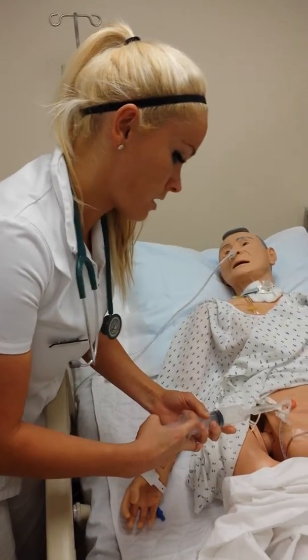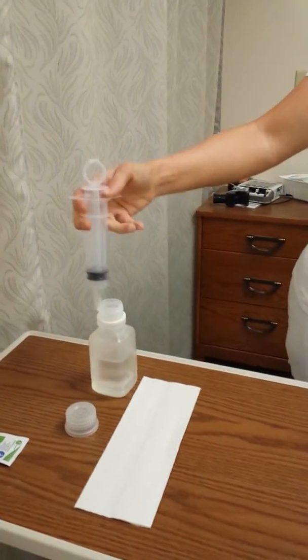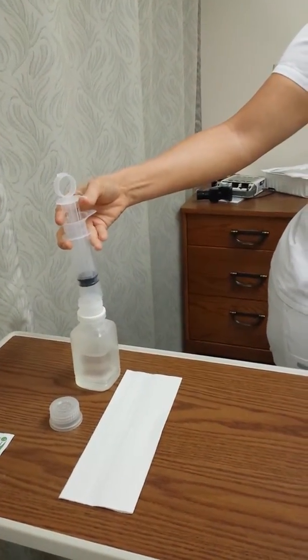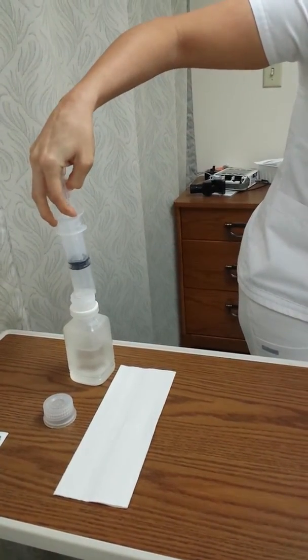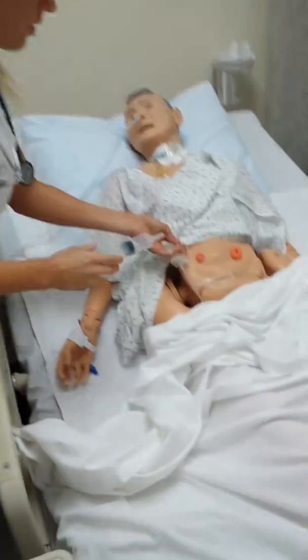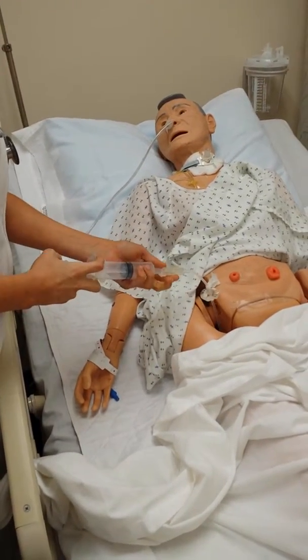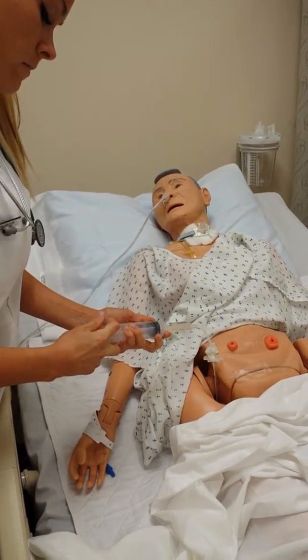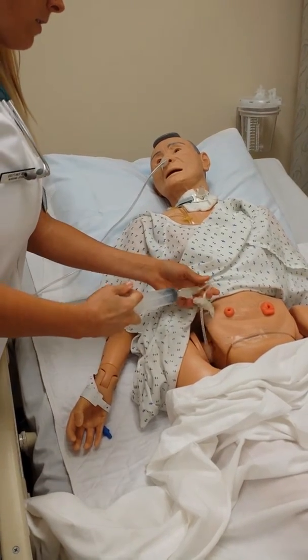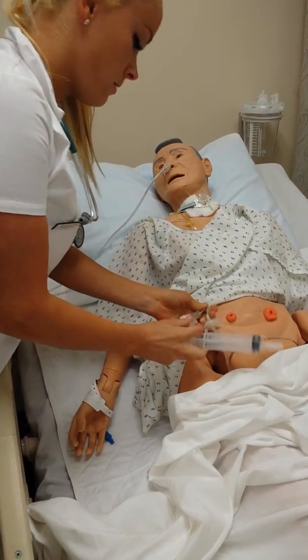This was under 100cc, so we're going to push that back in and clamp it. Then we want to irrigate — we're going to draw up 30cc's of tap water, make sure it's 30cc's, attach it, unclamp, and flush slowly. Then clamp it closed, and that's it.